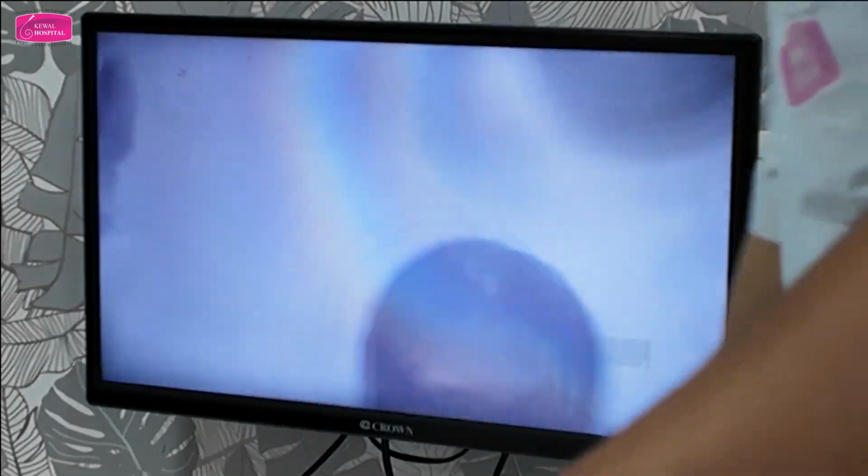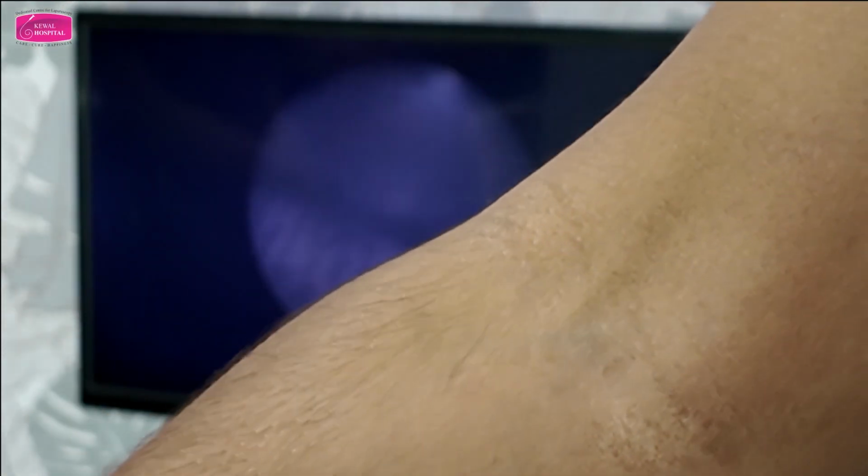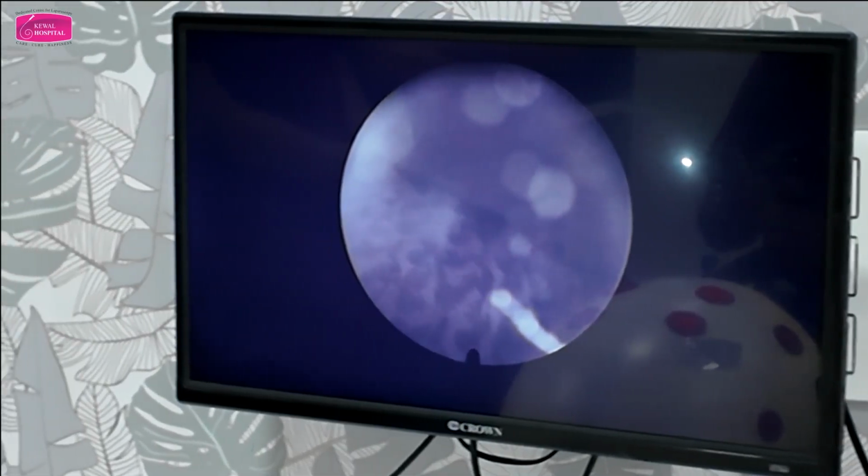Again, for that, here, camera. See, for hysteroscopy, you need assistants who can help you properly, who understand how delicate the things are. Now I'll keep the sheath here and we will use the operative sheath. I'm delicately, carefully putting in the scope inside. Align. 2 dots, notch, align, done. This is the camera. The assembly is same. Again, the light cable will go from below.